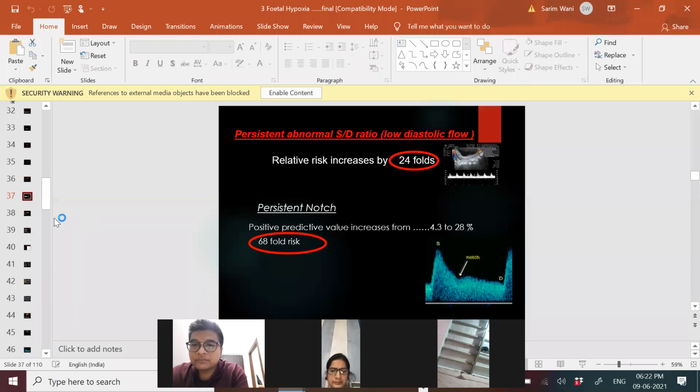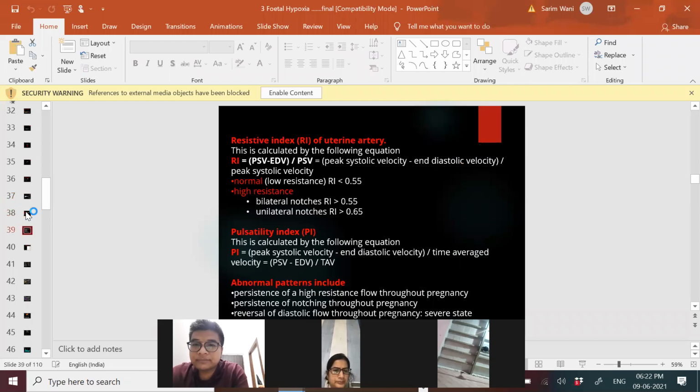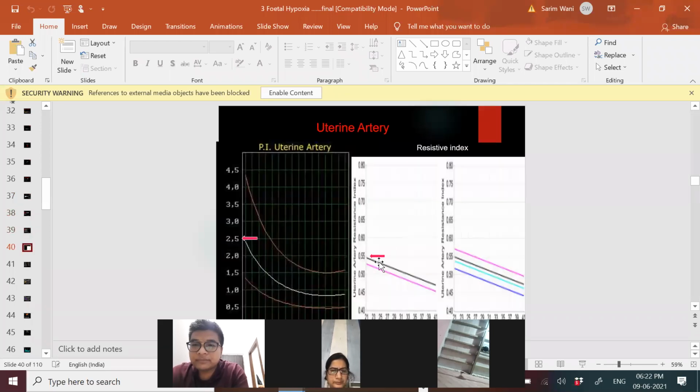Now, go back to this chart. Now, coming to Dr. Sandhya again. Dr. Sandhya, I am not torturing you; because you are a gynecologist, you should know these points. That is why I am coming back to you time and again, because this is a gynecology-related question. Now, in an infertile patient, that resistive index, what will you expect, to go up or to go down? If normal is 0.55. So go down. Think again. Resistive index, will it go up or down?